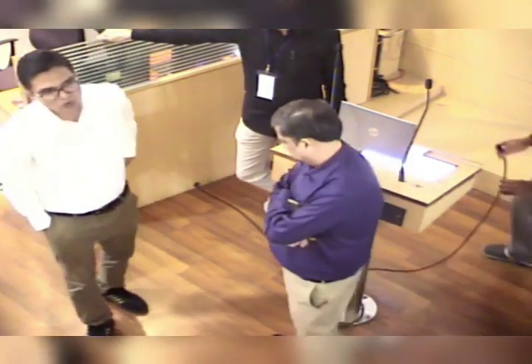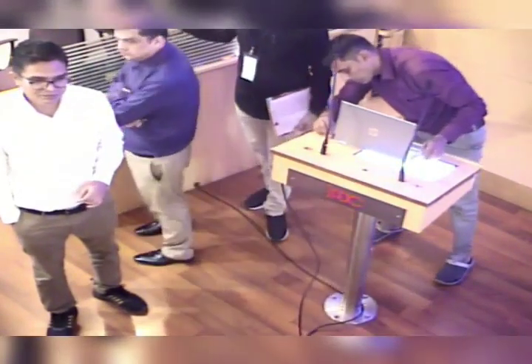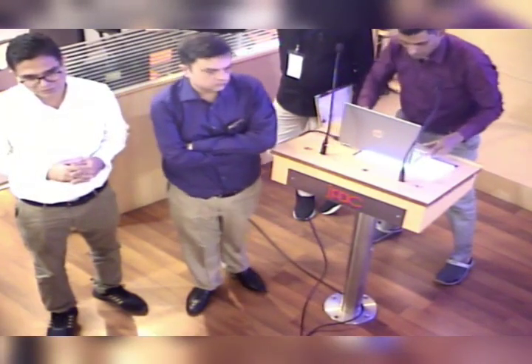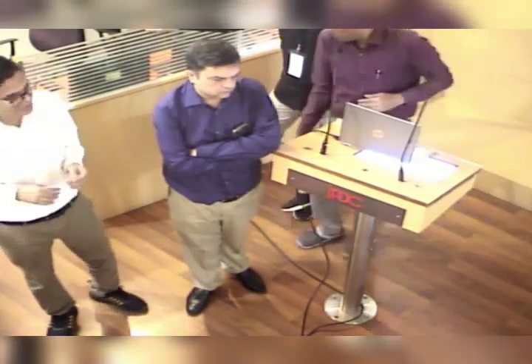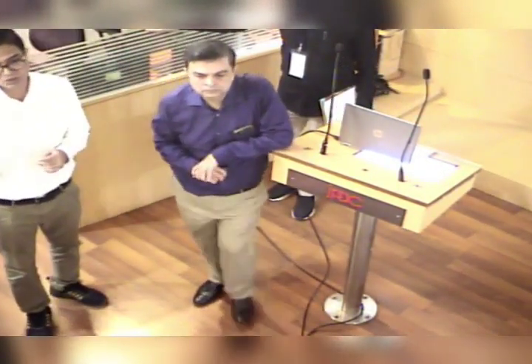shoulder arthroscopy. In that I utilize interscalene or superior trunk. In a few cases I have utilized costoclavicular block also, just to check whether the costo can be utilized for shoulder surgery or not, along with supraclavicular.